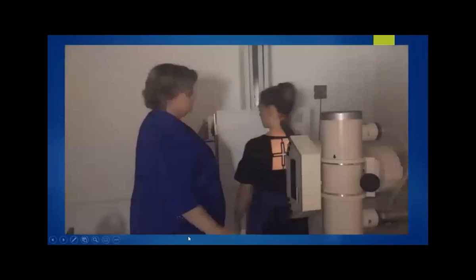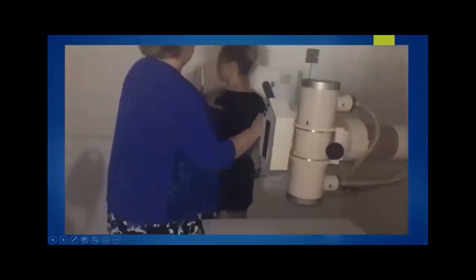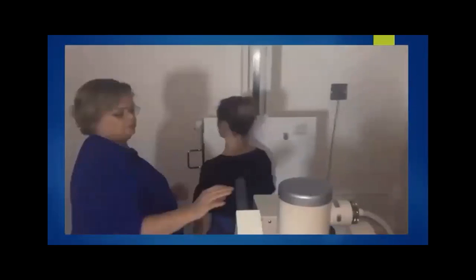So with this, it's called a scapular Y. The shoulder that's hurt is touching the board. We are turning them to get the scapula on its side or laterally. In the x-ray, it's going to look like a Y. I will show you how to position the right amount of obliquity. It's going to vary on each patient. So you get that scapula straight on, looking down.